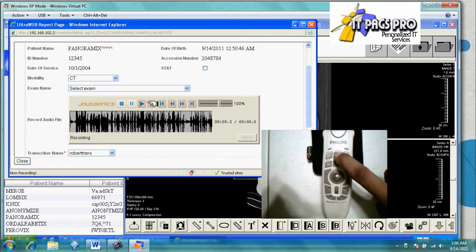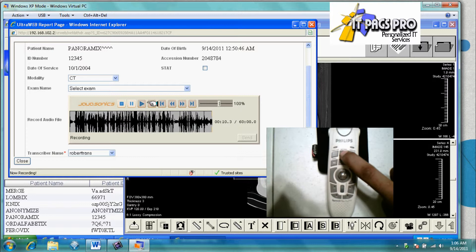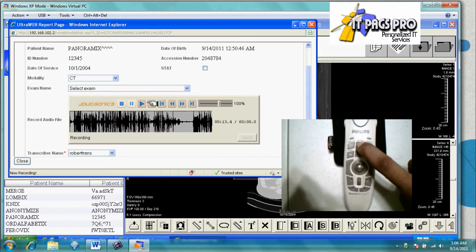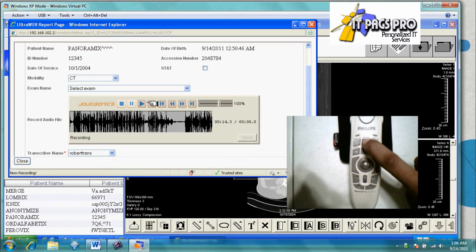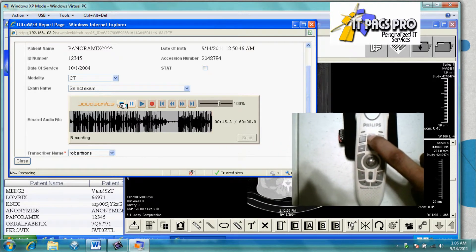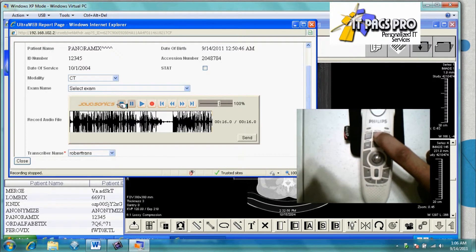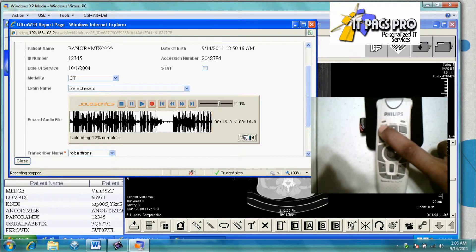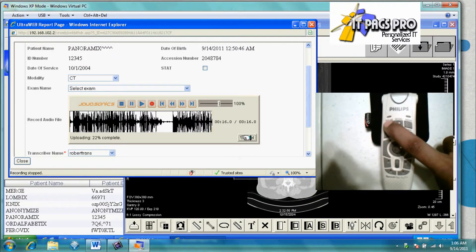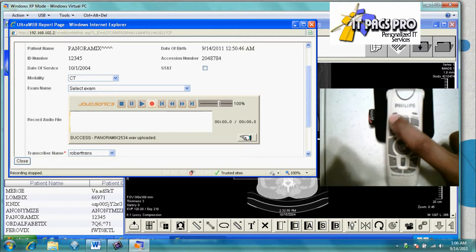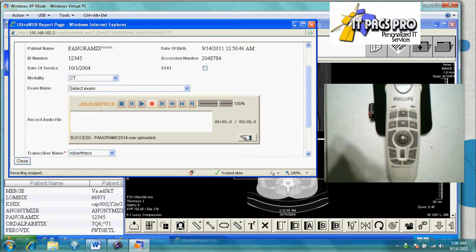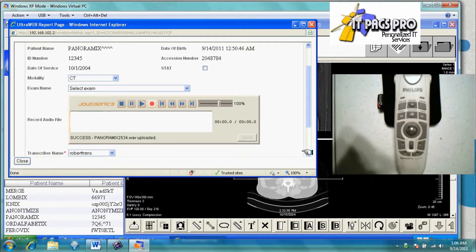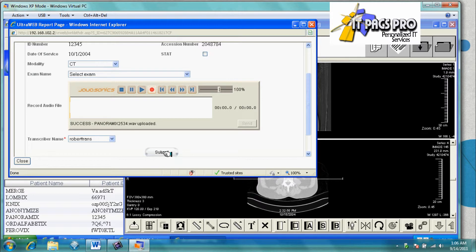As the audio is being recorded, we have an additional button on the speech mic — the EOL button — which allows the user to submit the audio without having to return the mouse back to the slave screen. Finally, the user will submit the record to the transcriptionist.